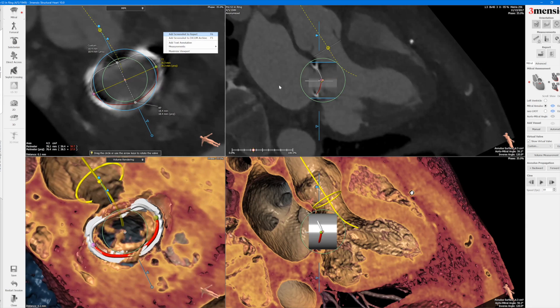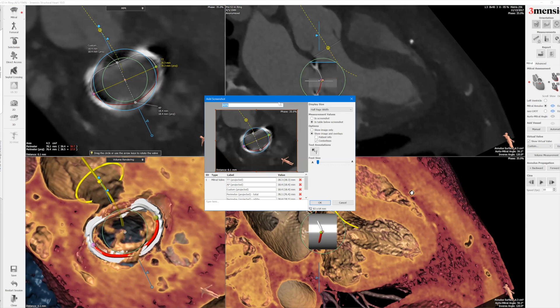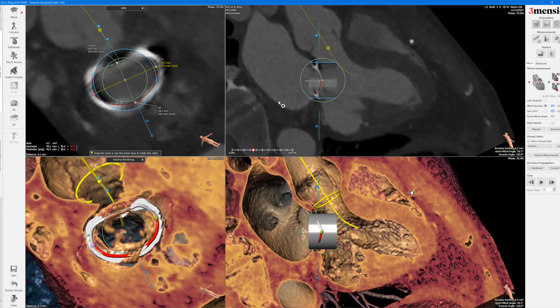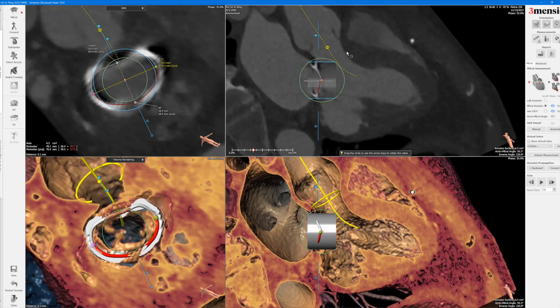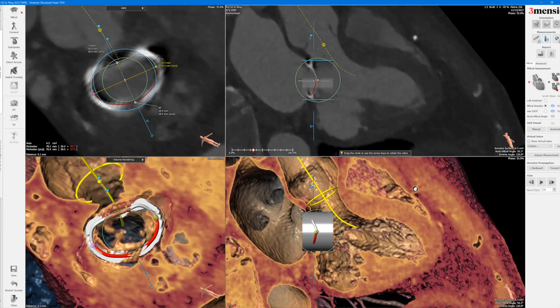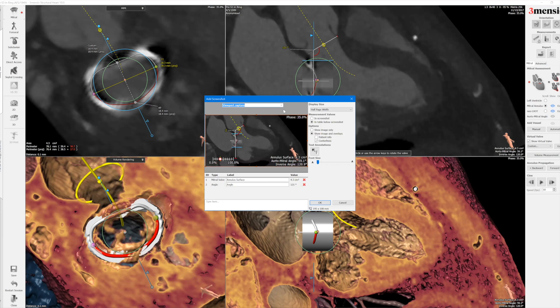I would typically add these pictures to the report, noting 26mm S3 MVIR and a 28-millimeter ring. You can also do the aorto-mitral angle here — use the angle tool to draw the angle, and in this case it's 121 degrees. You can label that as such.